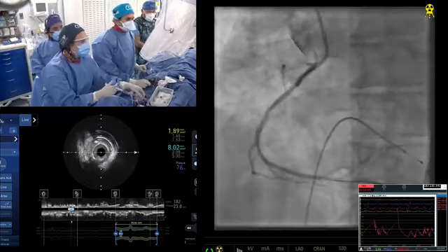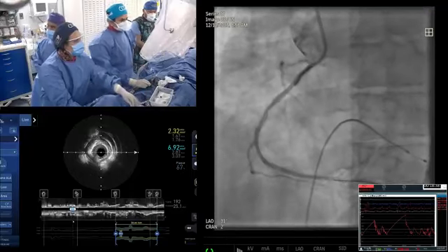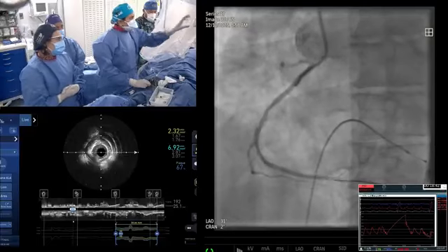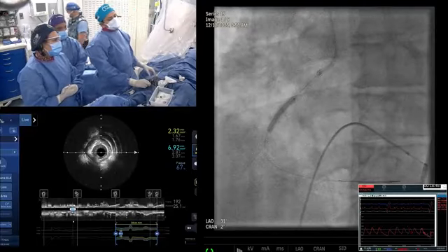So I think to me, see that perfect result. Balloon expanded. I know what you want to do now. I think your balloon expanded mid area, you can go a little high pressure. Cutting balloon, because of the circular calcium. Come look at the angio. You want a 3.5 cutting balloon? Or the mid? Distal is very good.